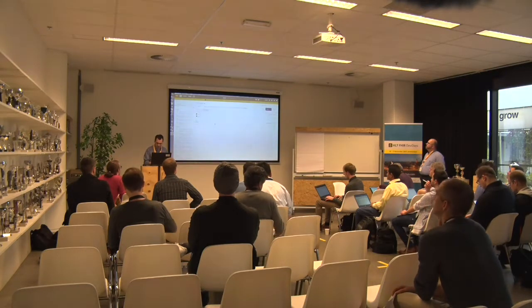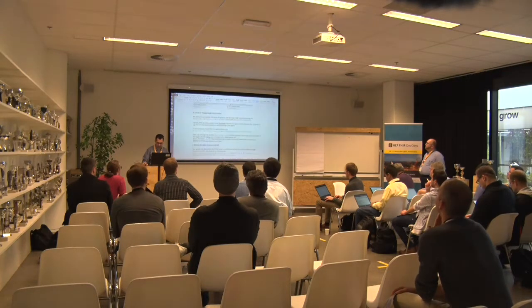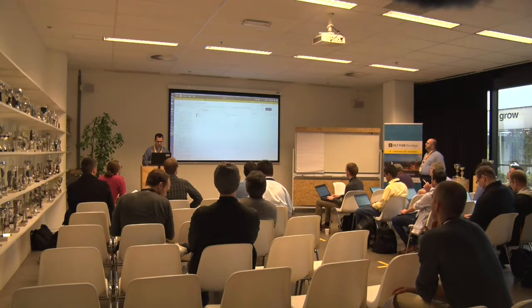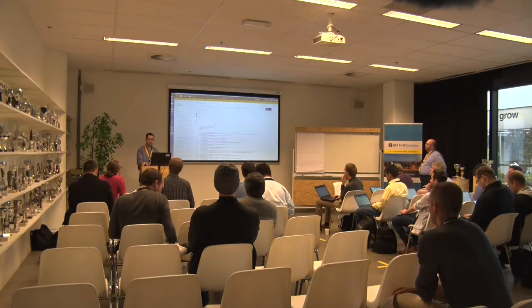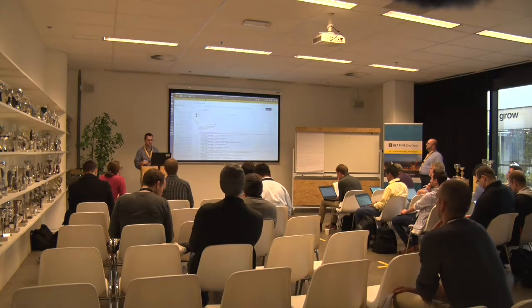Oops, what did I? Slash. Oh yeah, the slash instance, that's what we need. Sorry. Right now we're just looking to discover more than actually retrieve. So when I say slash instances, that means tell me about all the individual objects in that study, and in typical DICOM fashion, everything comes back as a multi-part HTTP response.